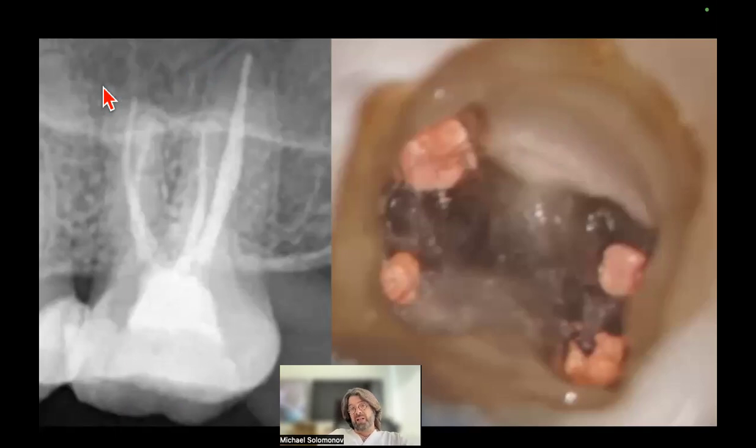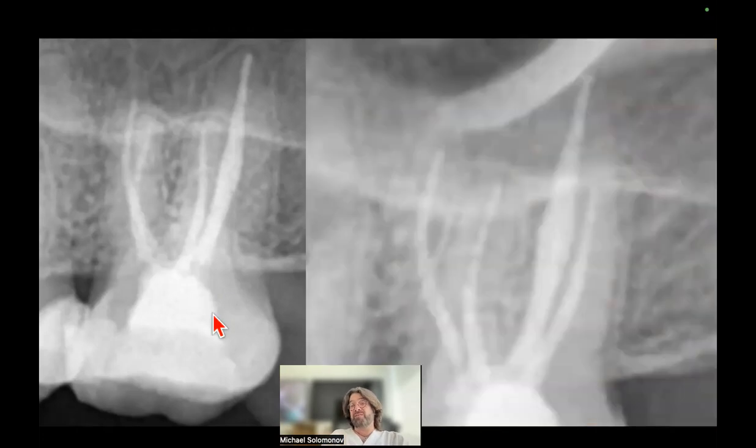And this is the final result. Again, I like to see how uneven our canal is. You see some narrow parts and the palatal canal, wide part, narrow part. Again, it's very nice to see this anatomy. In many of my cases, and in some, two or three, I like to take different angle X-rays to see the final result. I did the same in this specific case.